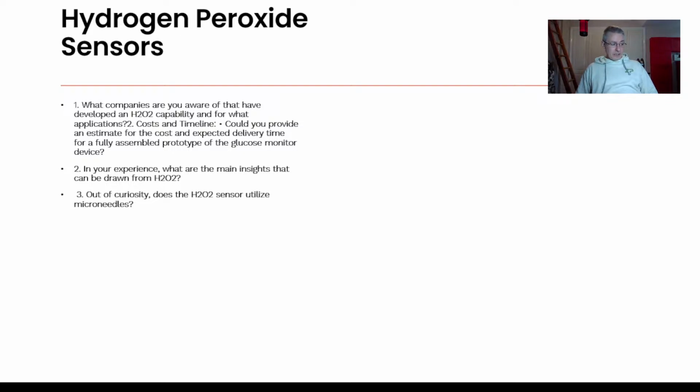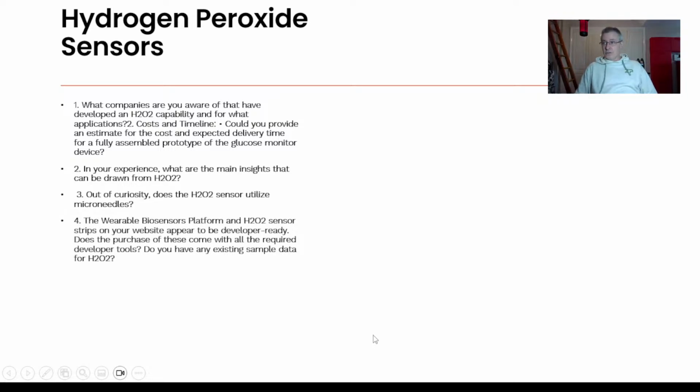In terms of microneedles, the people leading, which is a strong word, at least in the public domain with the highest profile, would be Biolinq. Biolinq are probably doing what's called a generation 1 glucose sensor. So on their microneedles, they will have glucose oxidase. The glucose oxidase will react with the oxygen and glucose and generate hydrogen peroxide. So there are people using microneedles to effectively measure hydrogen peroxide. It's just not so apparent because of the biochemistry, but that's what's going on.